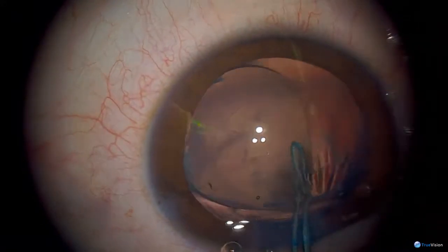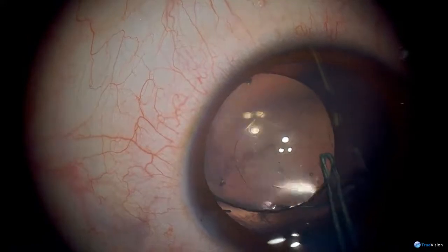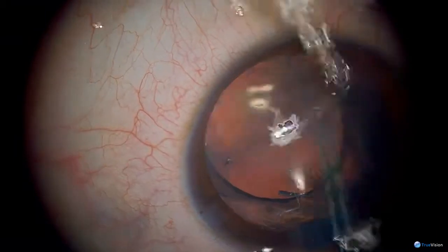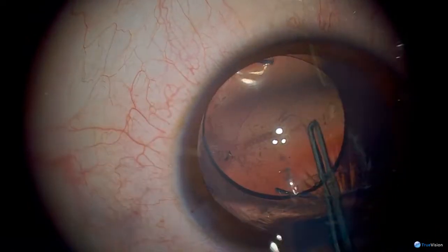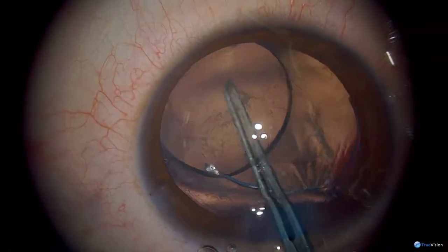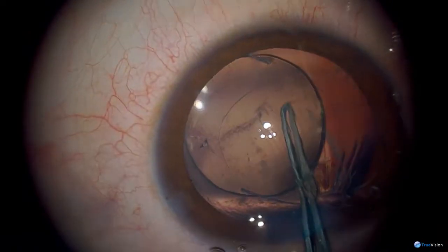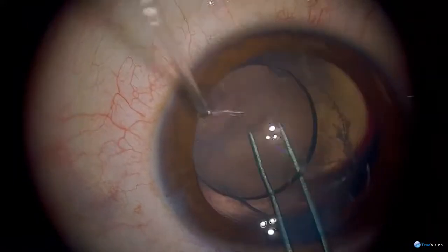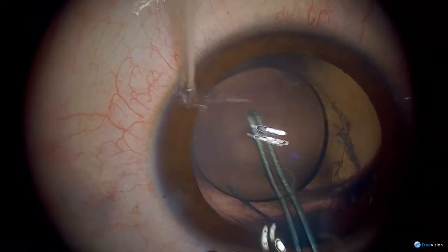Are you trying to remove the membrane under the IOL? Yes — I think this is the posterior capsule. I was going to do a primary posterior capsular rhexis, but he already has a hole in the capsule so I'm just making it bigger. The question is: why not just leave the posterior capsular membrane and do a YAG laser later? You could — but if you leave the posterior capsule it will opacify at this age in all patients. He wasn't a very cooperative patient, so I anticipated he'd be better off having this done. He'll probably need a laser within a year anyway.